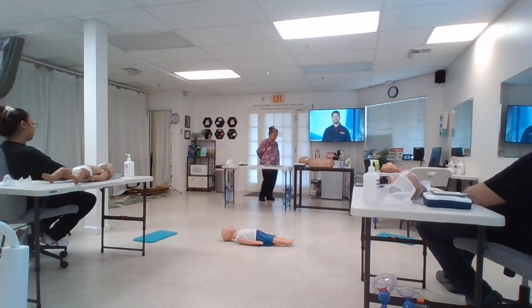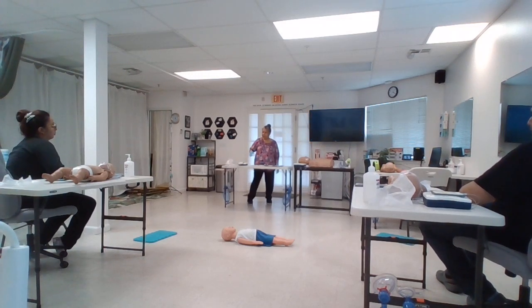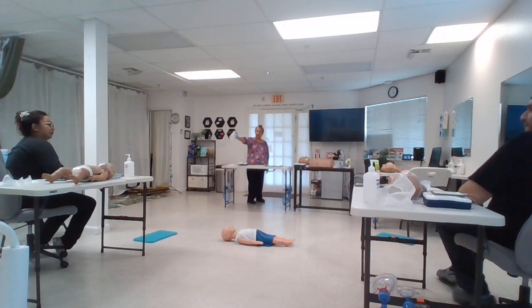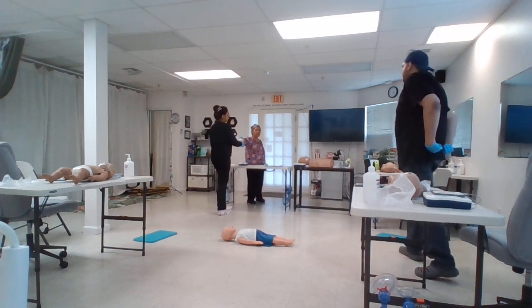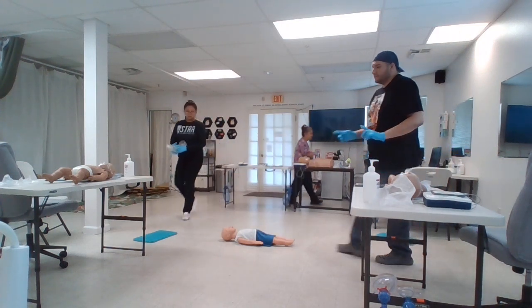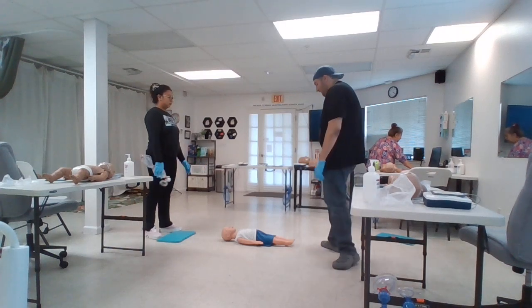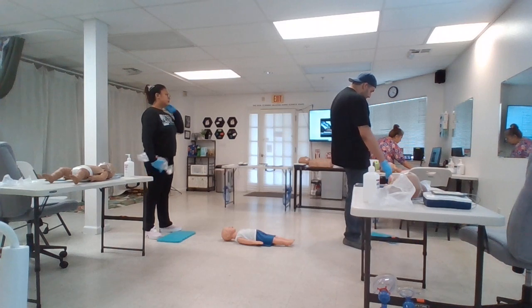We'll pause here while everyone gets ready. So who wants to be the first responder, the compressor? And you'll be the bag mask guys. Remember, when you start compression, you have to move quickly, and then follow along with it. You guys are good?